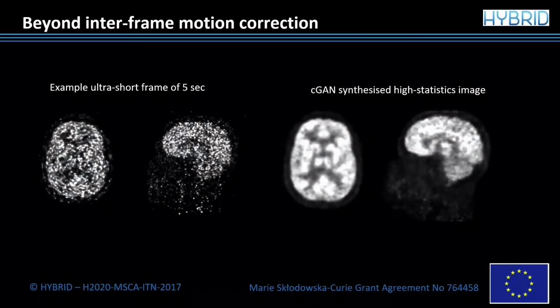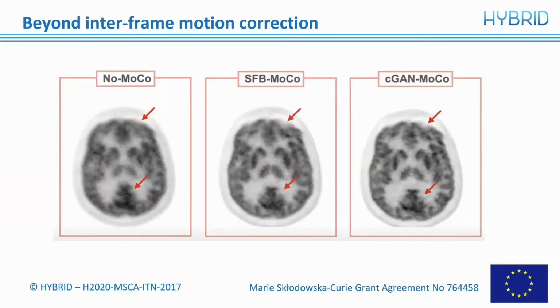We also tested PANDA with 5-second subframes in order to detect intra-frame motion to generate motion-free frame images in dynamic studies. And after motion correction, we obtained images qualitatively superior than no motion-corrected images or registered without a PANDA preprocessing.